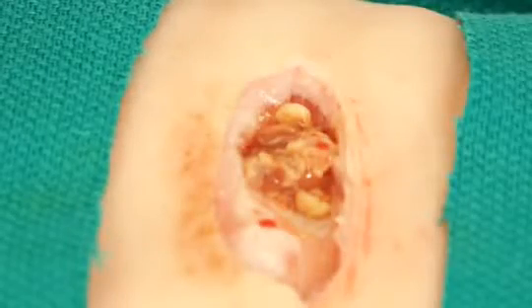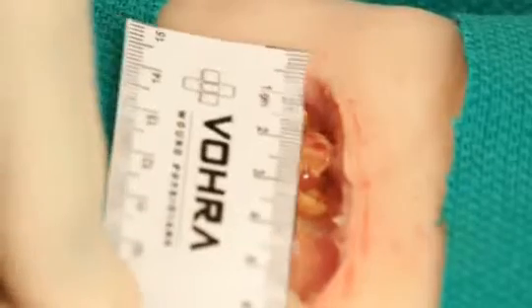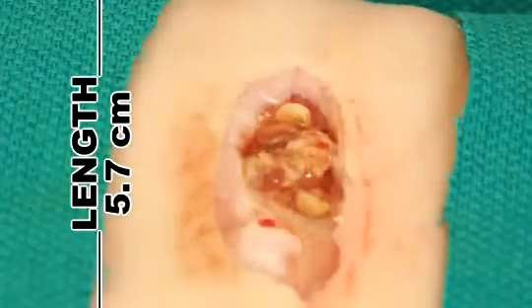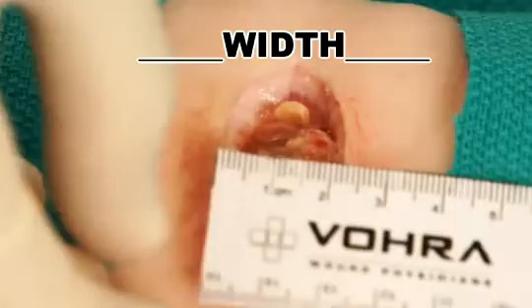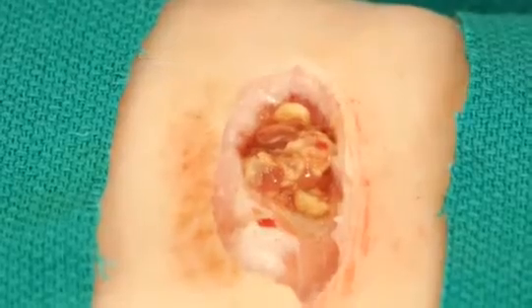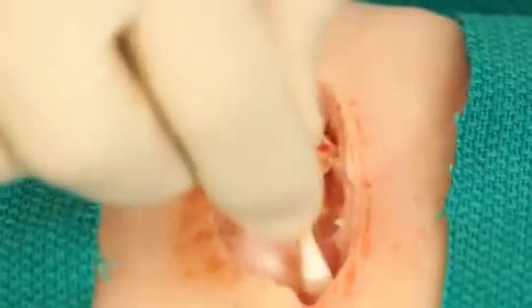In this particular instance, we would start off by measuring the wound in the length dimension, where there is the maximum length of this wound of approximately 5.7 centimeters. The width would then be measured at its maximum point of width, which is 2.5 centimeters.